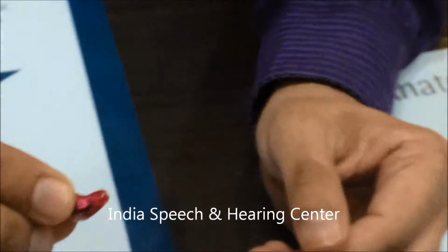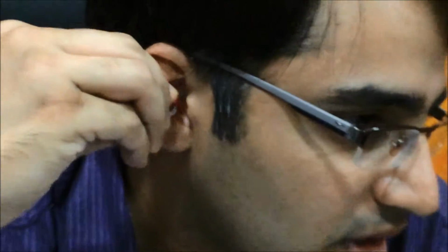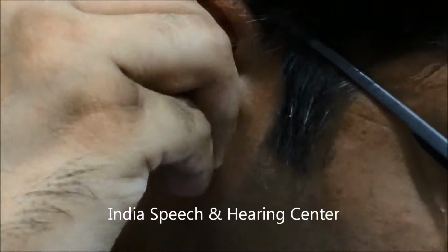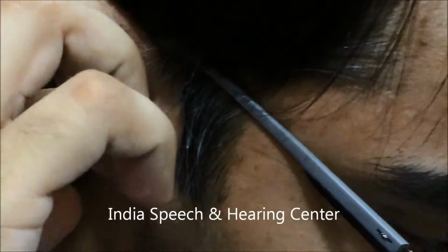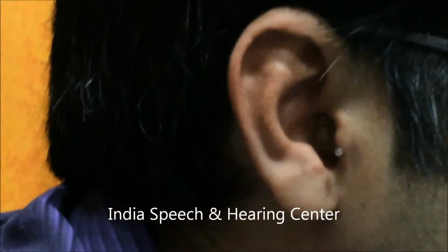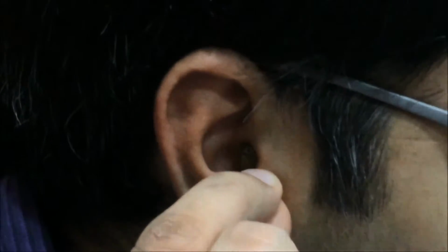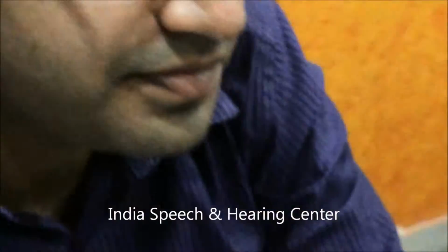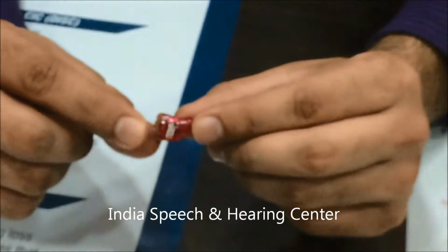So you can hold the hearing aid like this, and you can take this hearing aid straight to the ear. You can position it inside the ear canal. With the other hand, you can stretch your ear for an easy insertion and gently put the hearing aid inside the ear. It will go exactly and sit in the place where it was designed to sit. And this is how the hearing aid will look like once it is inserted inside the ear completely. In order to remove the hearing aid, you can hunt for the thread which would be downwards in your ear, and you can pull it out. So this was the basic use, care and maintenance for a CIC hearing aid.